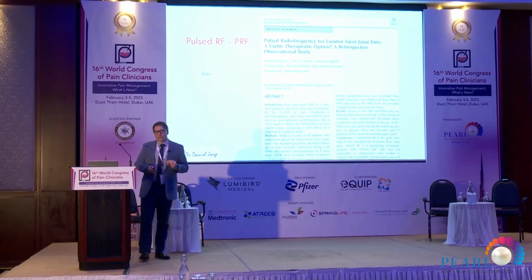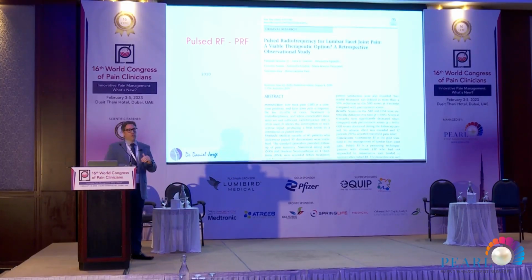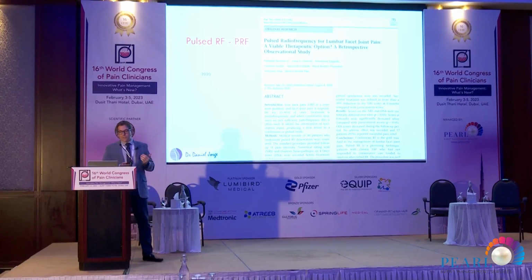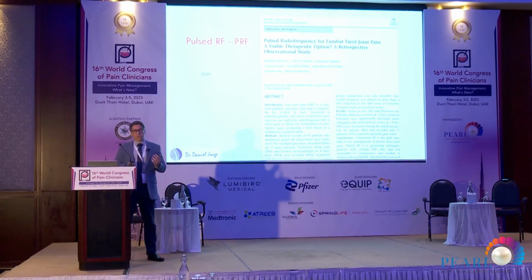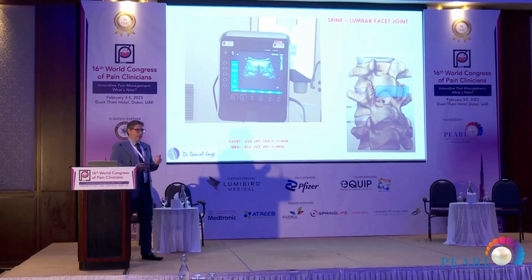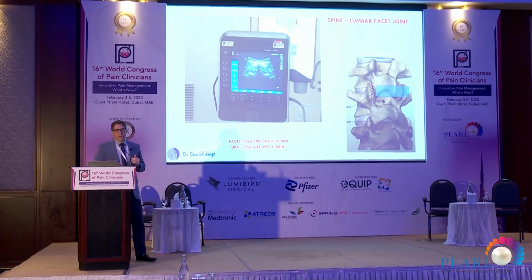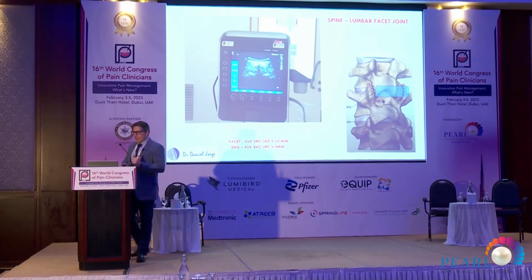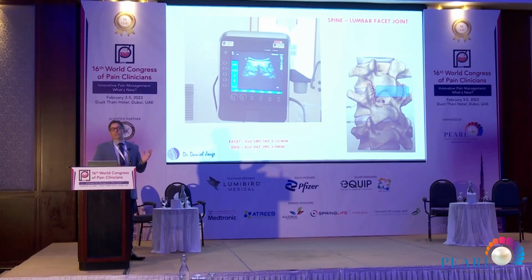We know that the spine is not in those gold standard results with the pulse radiofrequency, but some papers and articles like that in 2020 raise the same question. Pulse radiofrequency could be a viable therapeutic option for the lumbar facet joint, and we think so, and why not? I believe we have to make some adaptations, but we are seeing some good results with that as well. And we can do the procedure using the ultrasound as a guidance as well, even for the spine.